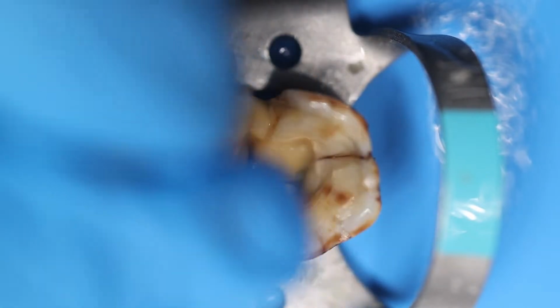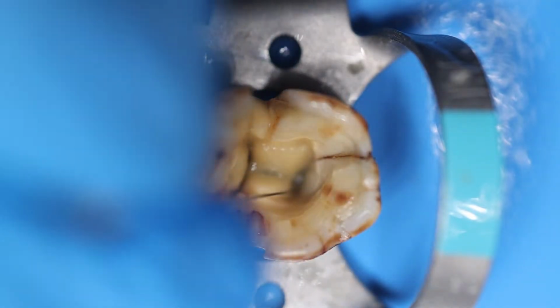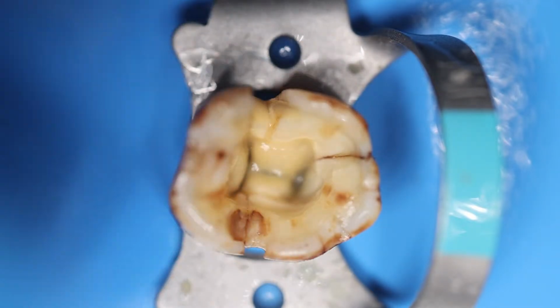Instead, if there is a perforation, then the file would not go smoothly, and you would not feel any resistance while withdrawing the file, because the file is not in the canal but is in the soft tissue, so you would feel a soft tissue feeling, and not the feeling of rubbing the file against a wall. So when you feel a file rubbing against the wall, this is a surety that you are in the canal, in a proper anatomical shape.